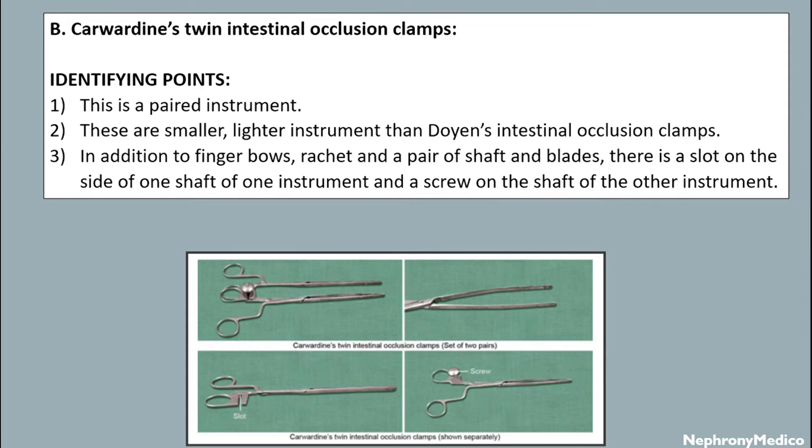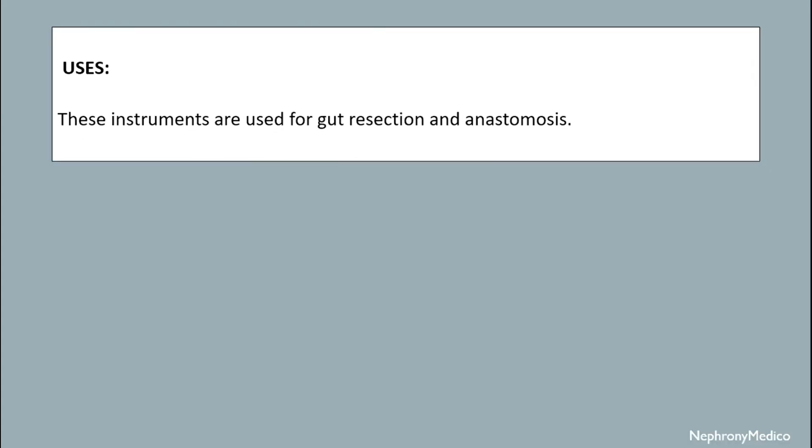Twin intestinal occlusion clamps — the identifying points are: this is a paired instrument. These are smaller and lighter instruments than Doyen's intestinal occlusion clamps. In addition to finger bows, ratchet, and a pair of shafts and blades, there is a slot on the side of one shaft of one instrument and a screw on the shaft of the other instrument.